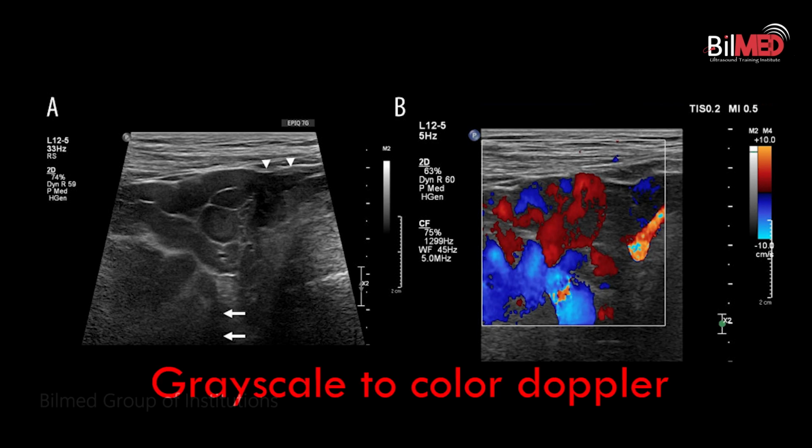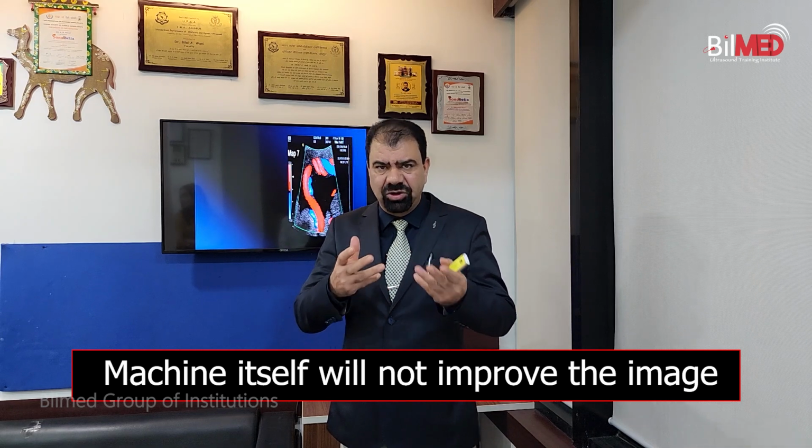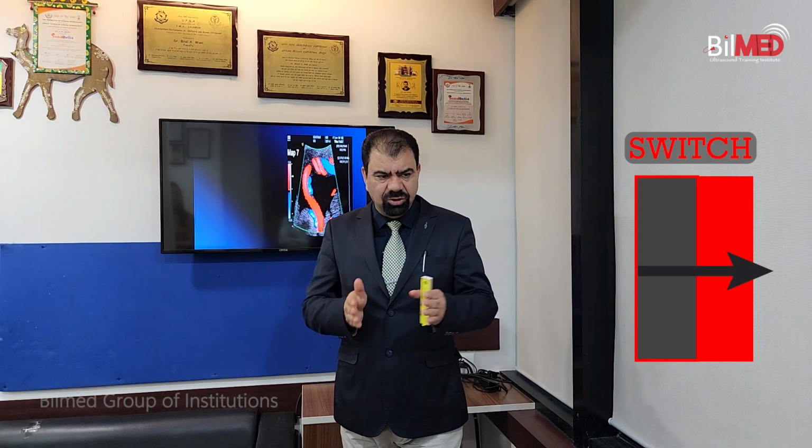Today we will be taking a short demo of what we have to do when we are switching from grayscale to color Doppler. The machine itself will not improve the image by pressing onto the color Doppler. Don't think that the machine's resolution will improve or that the machine will show you a good quality image. No. In fact, the resolution and the frame rate of the machine will drop when you switch from grayscale to color Doppler. That is why your grayscale image will get blurred.